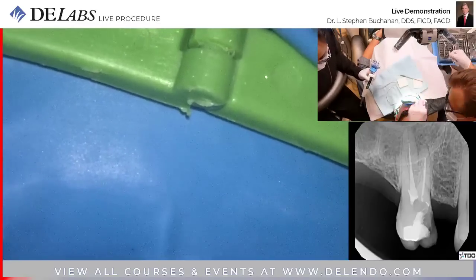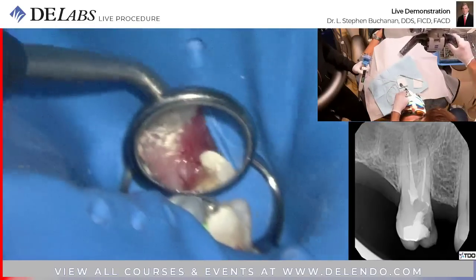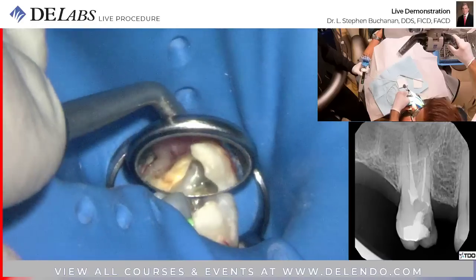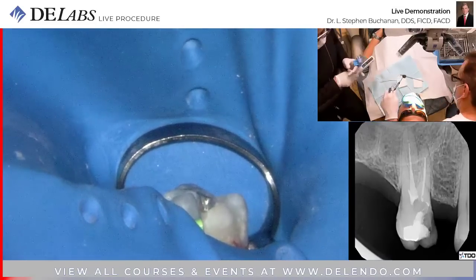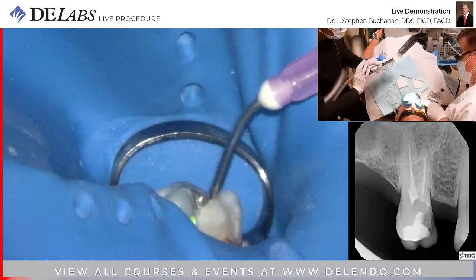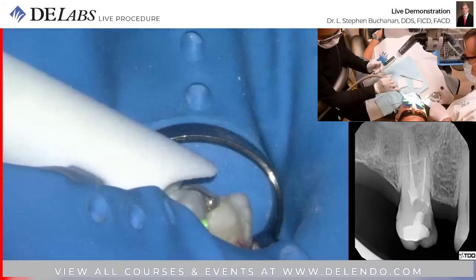Okay. So, what do we have? We have section. We're ready to gauge. Let's do the palatal first.